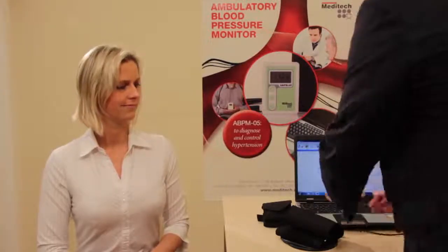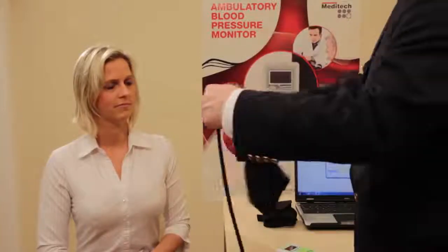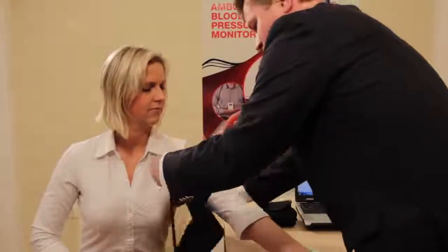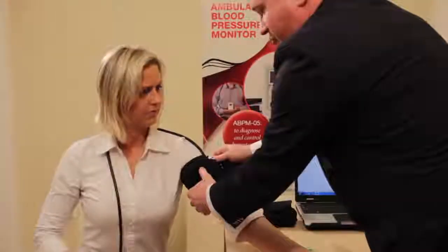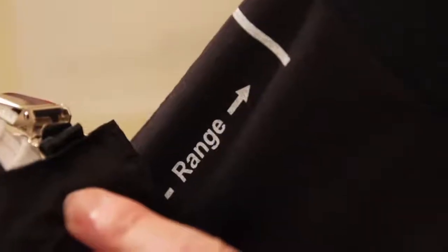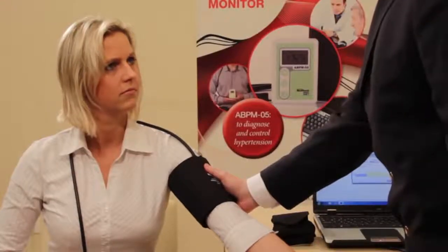So once the recorder has been programmed, either with the use of the computer or manually as shown before, the cuff has to be applied to the patient's non-dominant upper arm and connected to the programmed recorder. With a normal-sized cuff, it should be connected, as I said, to the non-dominant arm in the way that the small marker should optimally fall to the artery line, and the end of the cuff should fall in the proper range marker. If the arm is thicker than would fit in the range, please use a larger size cuff. If it's thinner, please use a smaller size cuff.